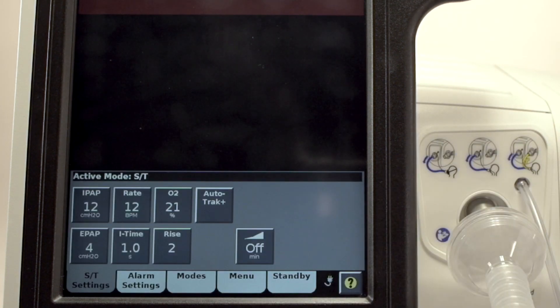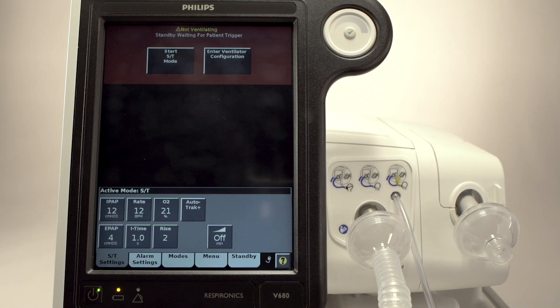V680 will continue in Standby mode for you to fine-tune the patient's settings. Adjustments are made with the familiar Touch, Adjust, Accept method. V680 will stay in this suspended state until it detects you have either connected it to a patient or you touch the Start button.